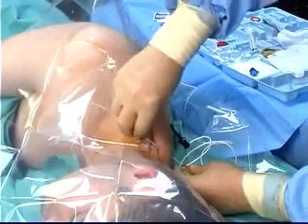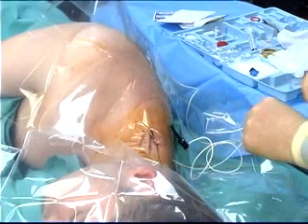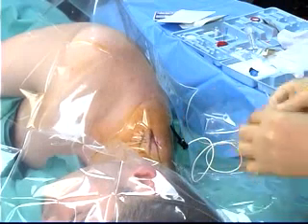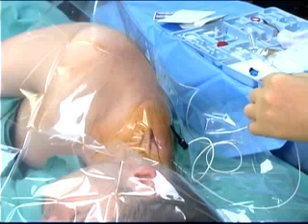The proximal end of the catheter is fed through the needle, and the needle is removed, leaving a loop of catheter. The silicone tubing that protected the catheter tip during packaging is handy to use to protect the skin bridge. This skin bridge makes removing of the catheter easier, but may be more prone to leaking of local anesthetic agent.